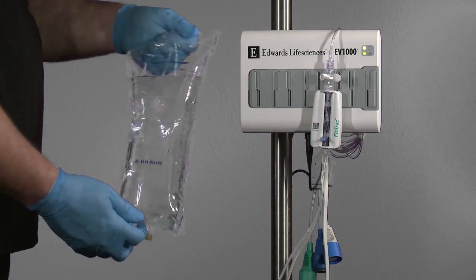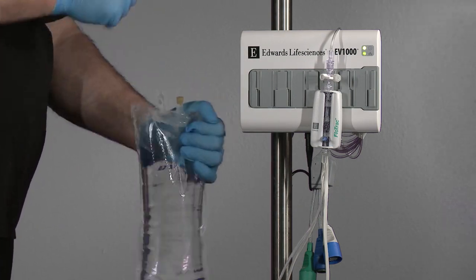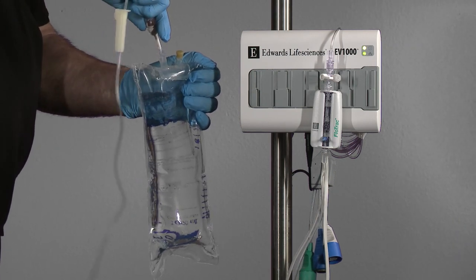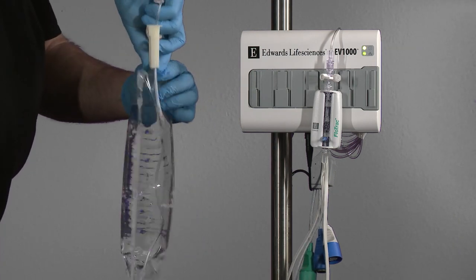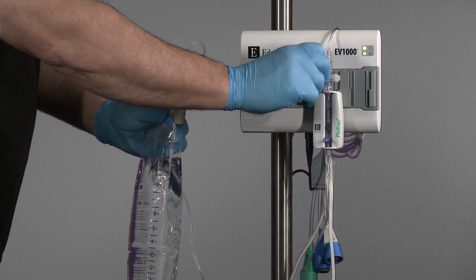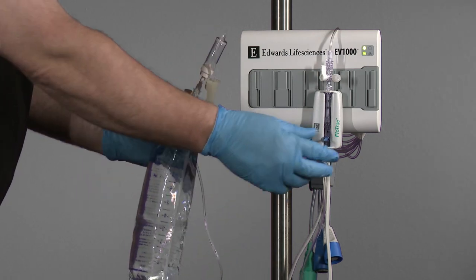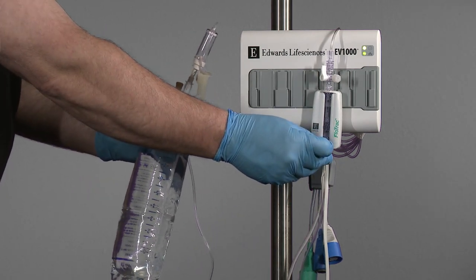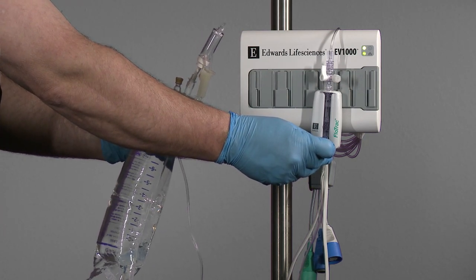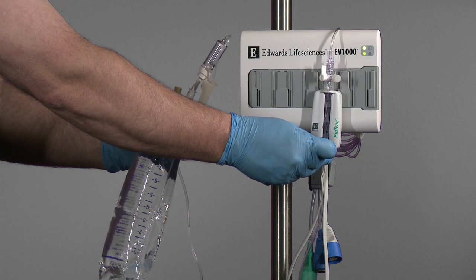Invert the flush bag, allowing air to rise to the base of the bag. Spike the flush bag with the fluid administration set. Turn the FlowTrack sensor stopcock toward the pressure tubing. While keeping the bag inverted, place pressure on the bag with one hand while pulling the flush tab on the sensor to evacuate air from the bag, and fill the drip chamber halfway or full, depending upon institutional preference.